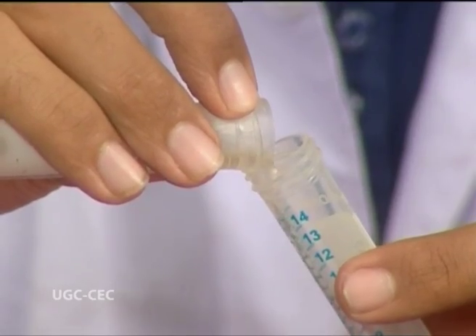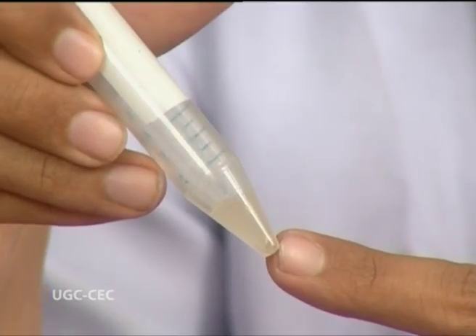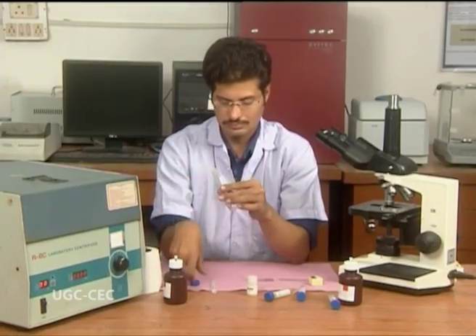The supernatant is decanted and a volume of 0.2 to 0.5 ml is left inside the tube.